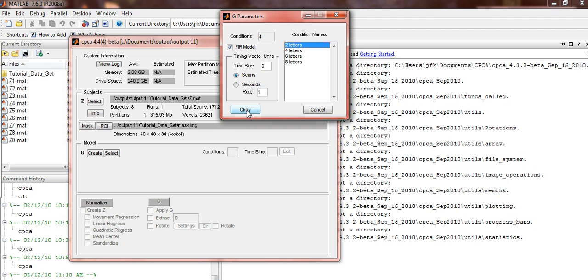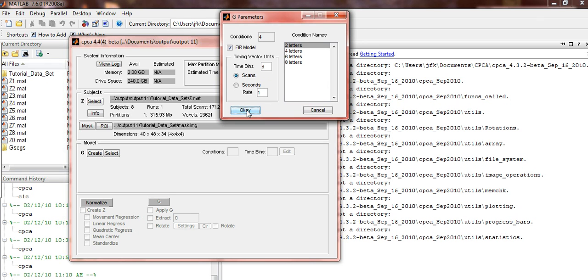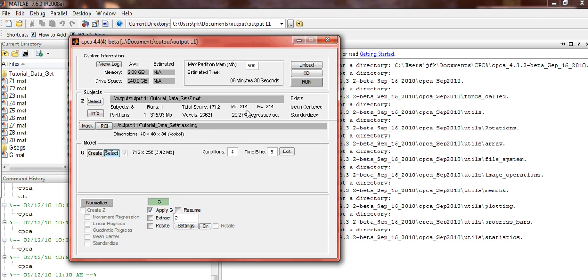Click OK again. Now, G under the Processing panel will be activated. Ensure that only Apply G is checked off. You will be extracting and rotating at a later time. Click on Run.